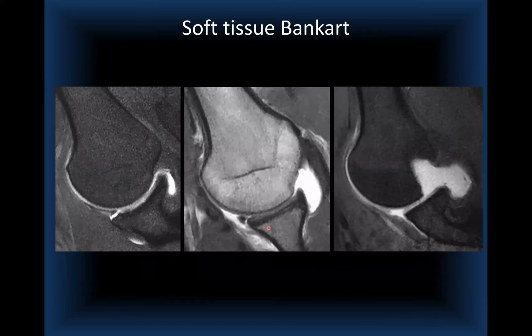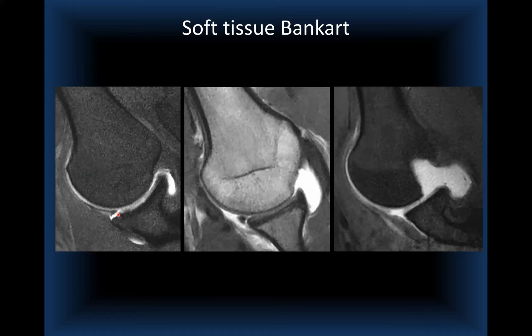Bankart and Bankart variants are well seen in the ABER position — Abduction External Rotation. We perform this on MR arthrography and sometimes on routine MRI when instability history is known. In ABER, tension is placed on the anterior band of the inferior glenohumeral ligament, which lifts the anteroinferior labrum and allows undercutting of fluid or contrast, making the injury easier to see. In this case the labrum is completely detached.